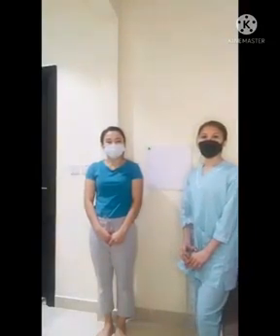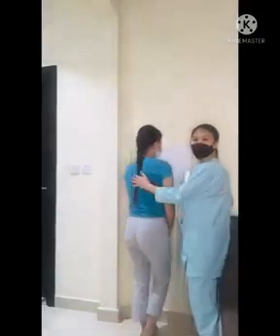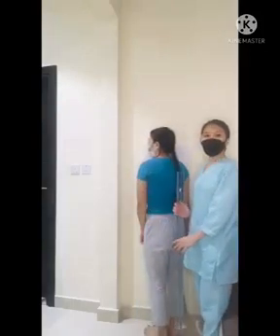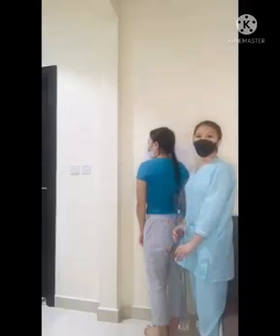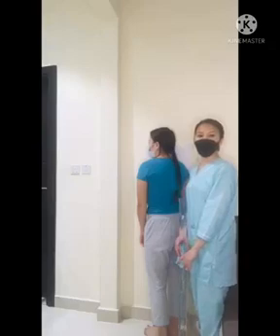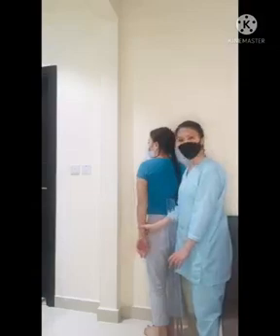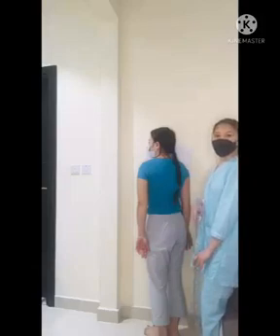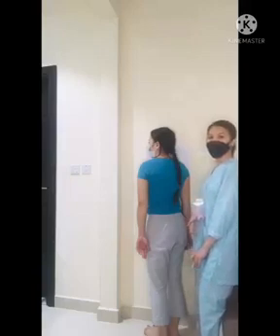So, instruct the patient to stand and lean backwards in extreme lordosis position, until the upper posterior thorax is in contact with the IR and the arms are in contact with the side of the support, resting head and neck on the support. Center IR to the mid-clavicle crosswise. So, instruct the patient to suspend respiration at the end of full inspiration to elevate and angle the clavicle.